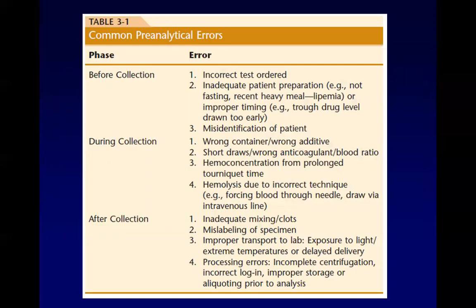Common pre-analytic errors include: before collection — incorrect test order, inadequate patient preparation, and misidentification of the patient; during collection — wrong container or additive, short draws, and prolonged tourniquet time leading to hemoconcentration; after collection — inadequate mixing, clots, mislabeling of specimens, and processing errors.